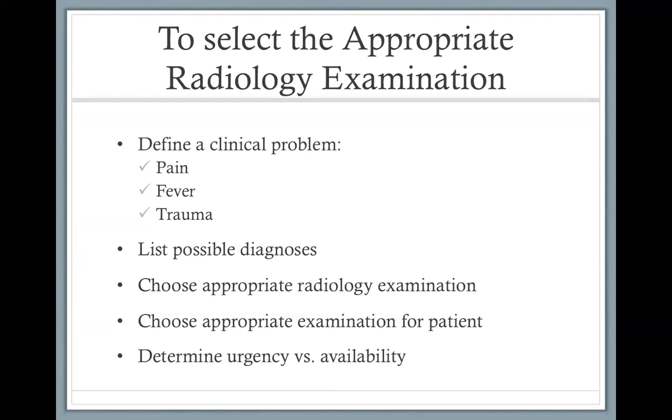Remember that we talked about imaging modalities that are better for younger patients, and those that are okay for non-young patients. For example, we said we prefer ultrasound for younger patients, and MRI, and then we say CT, we preserve it.